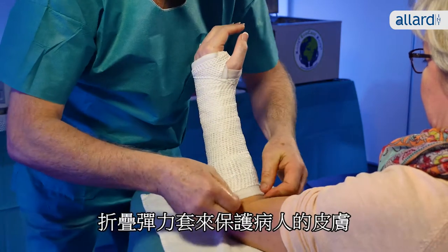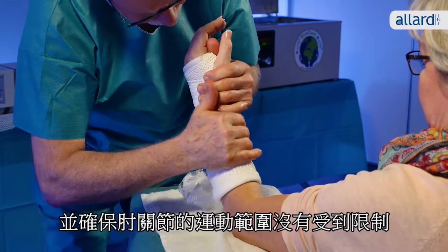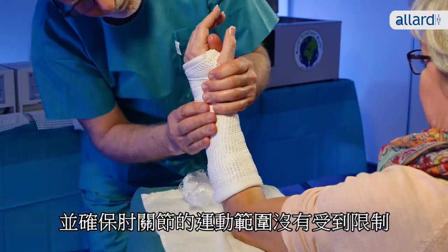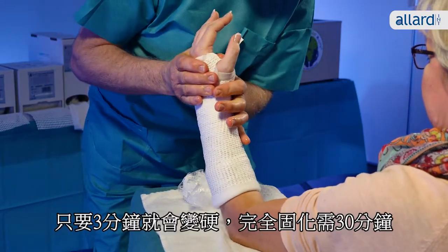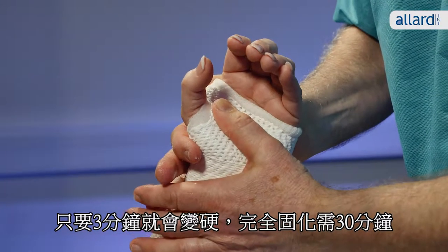Fold the stockinette around the edge to protect the patient's skin and make sure there are no limitations to the range of movement of the elbow. The cast sets after just three minutes and is fully cured after only 30 minutes.